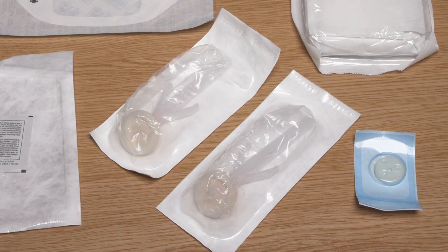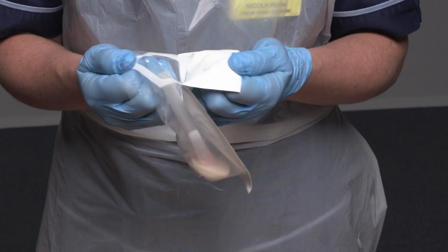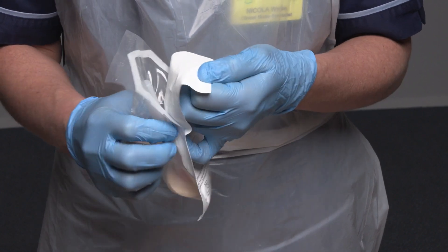For this device I will use a biopatch. During this procedure I need two wands containing 2% chlorhexidine and 70% isopropyl alcohol. It is fundamental that I use these as it is the most effective solution at eliminating any extrinsic microorganisms that might lead to bloodstream infection. I open the packaging of one wand onto the critical aseptic field.